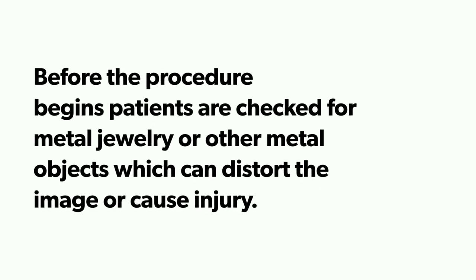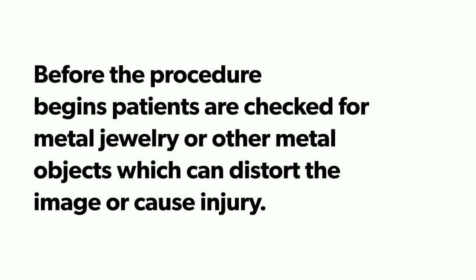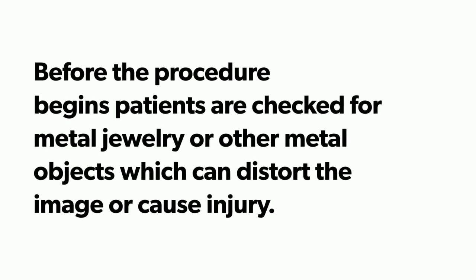Before the procedure begins, patients are checked for metal jewelry or other metal objects which can distort the image or cause injury.